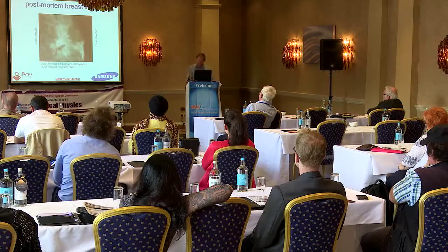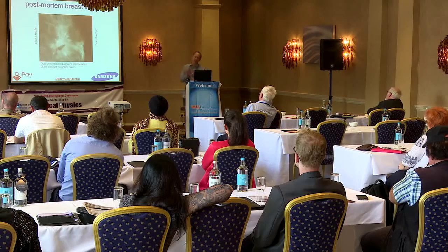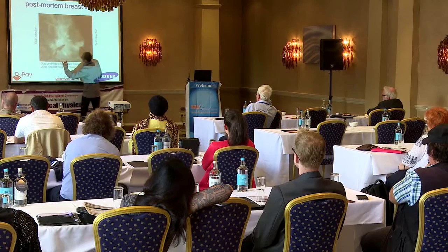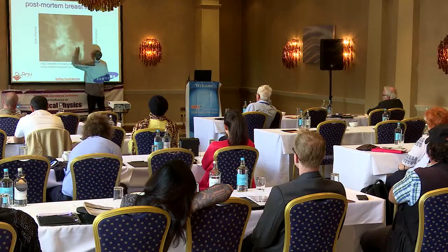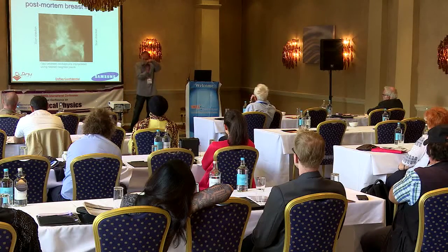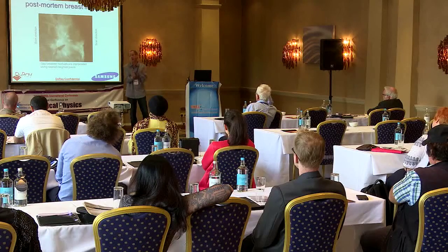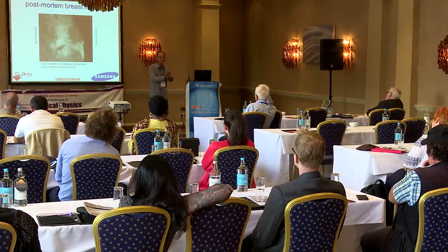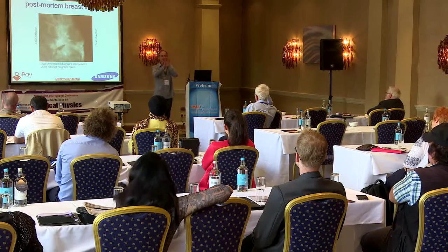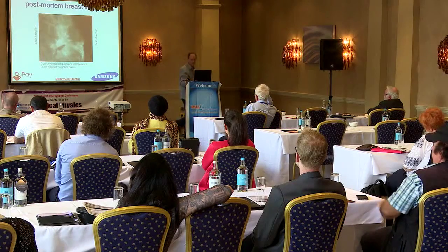One of the challenges that we're working on right now is that with the silicon strip detectors, we cannot use smaller pixels and tile together to preserve the pixel pitch, so there are small gaps. The very, very small gaps you can see as a small line in the image. Unfortunately, in mammography, because of the need to detect microcalcifications and their geometry, this cannot be interpolated over. So currently we're working on a method of laying the silicon strip detectors on top of each other in 2 lines and scanning to eliminate the gap.